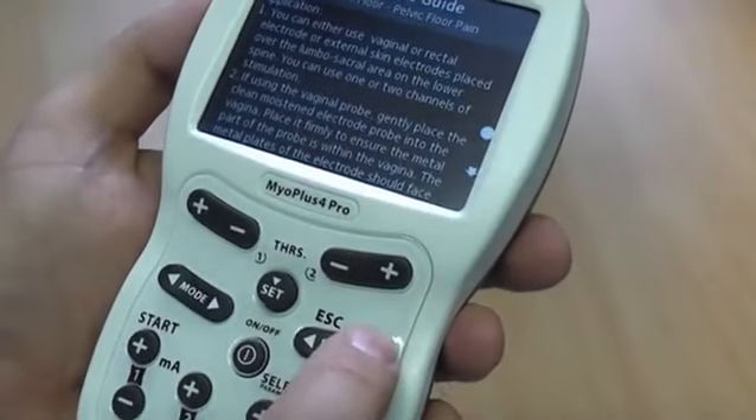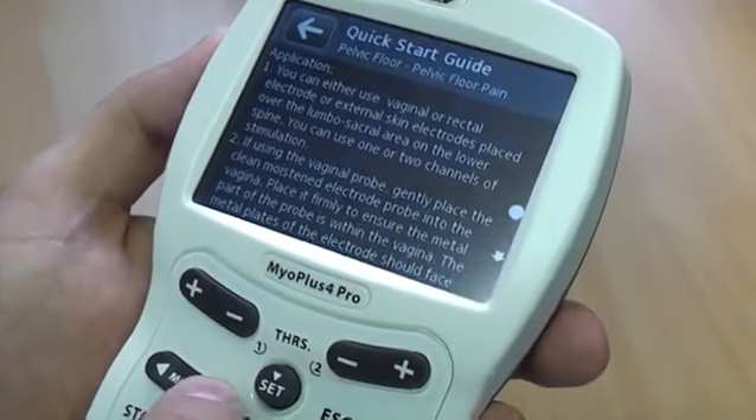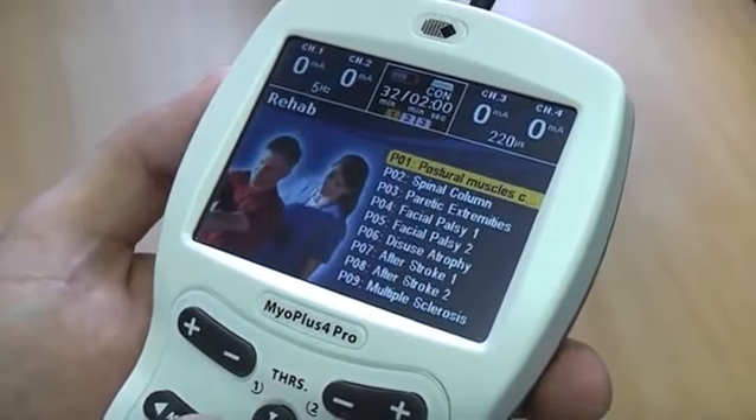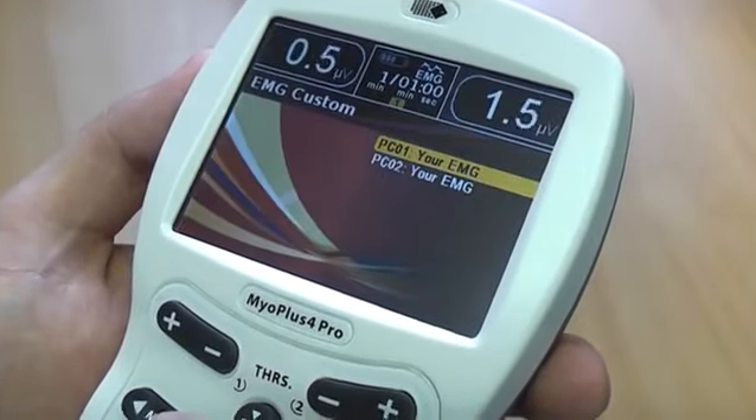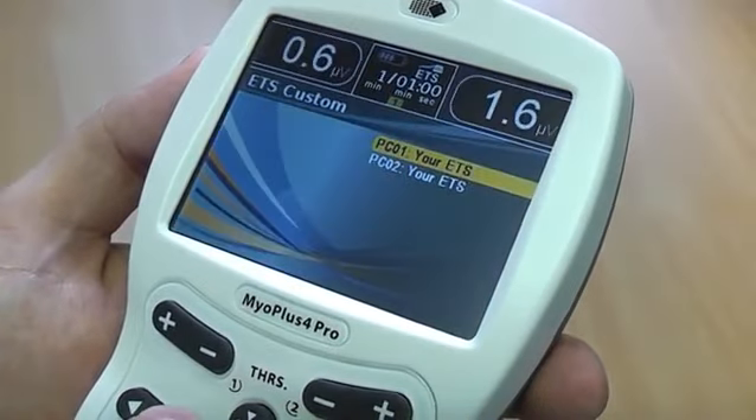The programs are categorised in groups called clinical modes. Press the mode button to navigate among the clinical modes. The modes are Incontinence, Rehab, and some other custom modes where you can set up your own treatment.